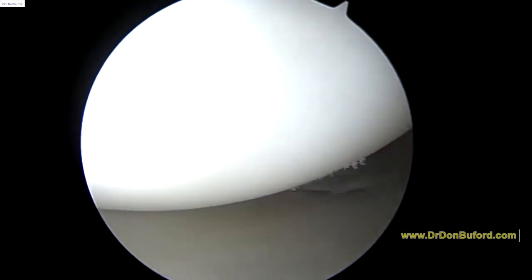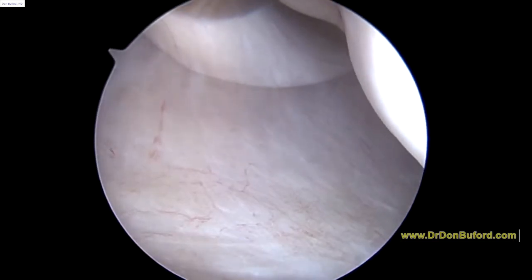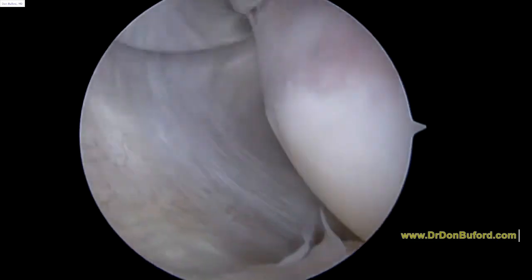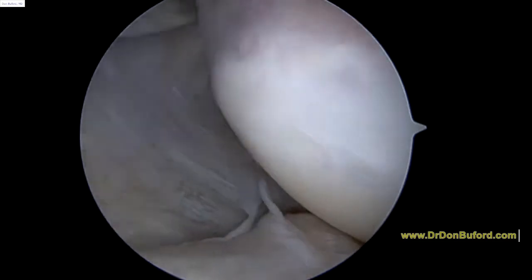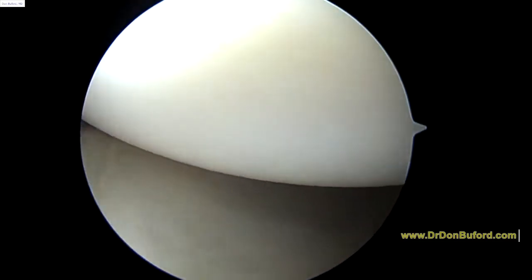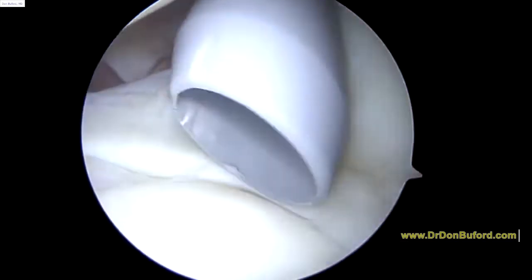As we come back around and look at the posterior aspect of the joint, this looks pretty good. Here's the posterior joint capsule. You can look at the insertion into the humeral head. No signs of any significant injury to the cartilage. And then here's the glenoid, which also looks like it's in pretty good shape. I'm going to go ahead and take a probe or something small, guys.